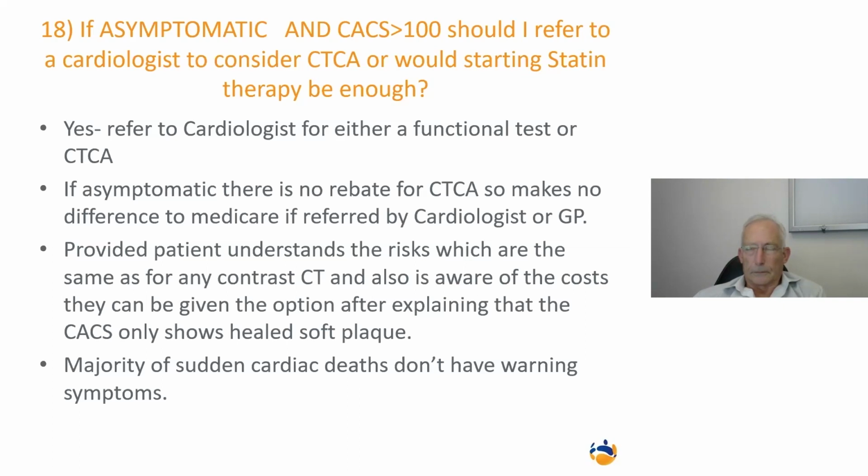If we break it up into ages of greater than 70, 5% still have a 0 calcium score. Less than 40, and this is the take-home message, less than 40, 58% of people will still have a 0 calcium score. So I think that's just another way of, hopefully I haven't confused anyone, but this patient should be on a statin in my practice.